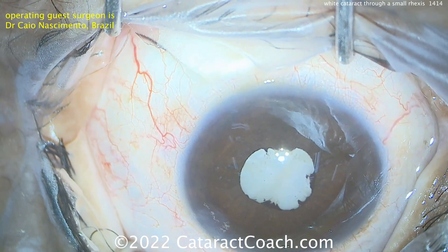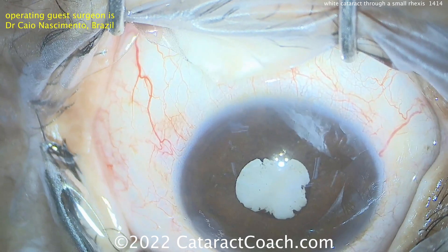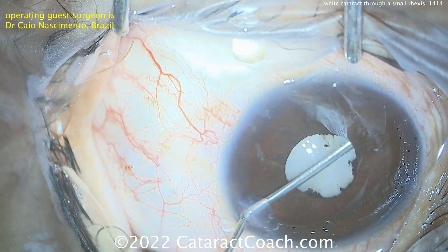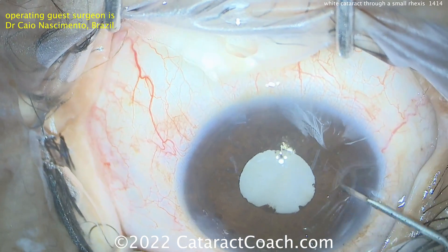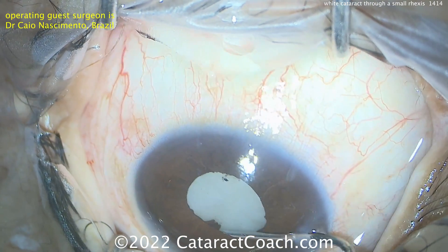And now you've got to break those synechiae. Looks like a very white cataract, probably an intumescent cataract. Patient looks to be on the younger side just based on those eyelashes there. So probably some anesthetic or lidocaine, phenylephrine, epinephrine going inside the eye, and breaking the synechiae. In this case, the synechiae are not too adherent.